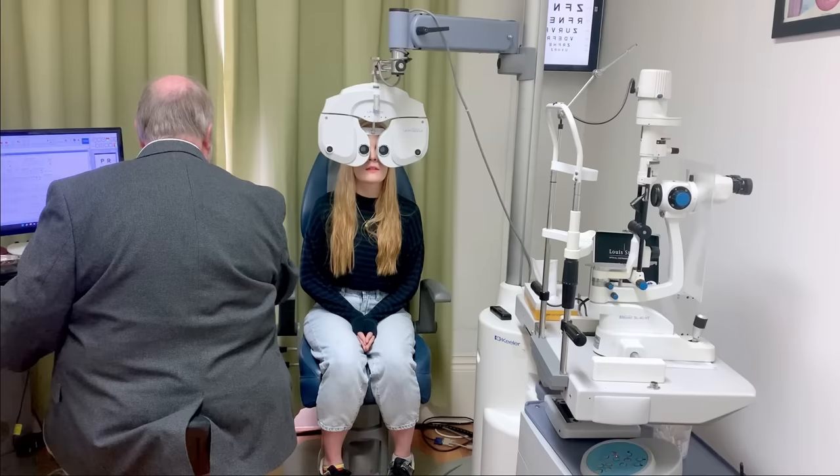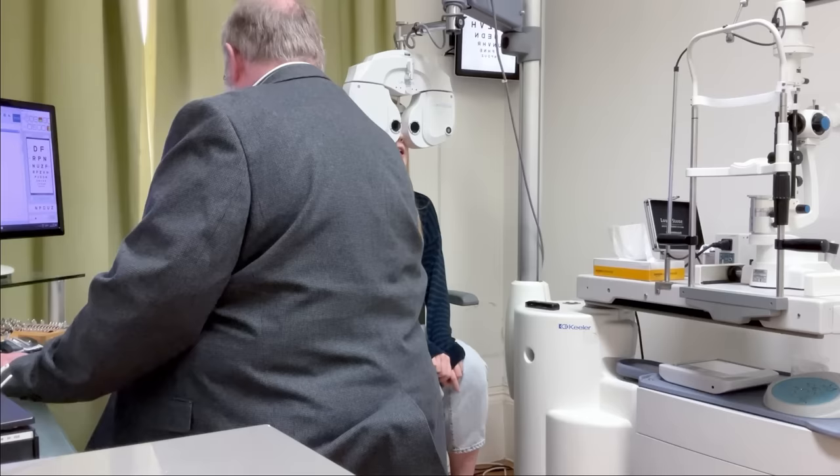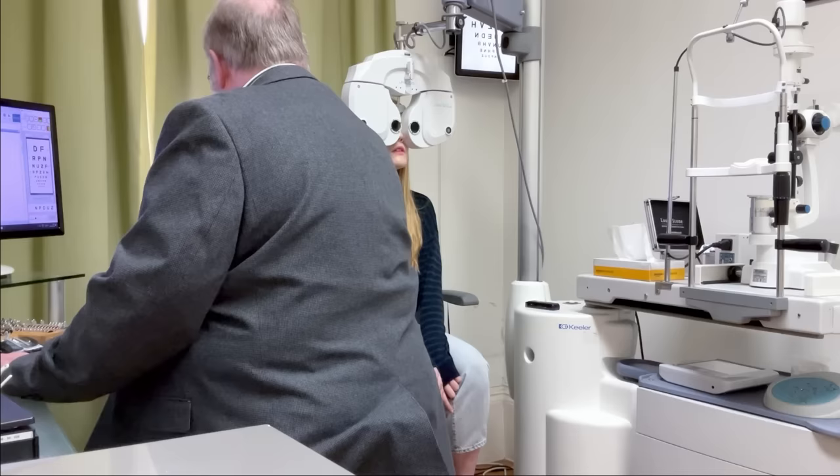Let me just take this one out. I'm just going to blur things a bit for you, okay? Can you see my letters there? Yes. Still managing the bottom line? Yeah. N-P-D-U-Z. Okay, any clearer there? I don't think so. Or better with that one? Yeah, better with this one. Okay. Let me come back to... I'm just going to fold this one. Just unfold that one. There we go.